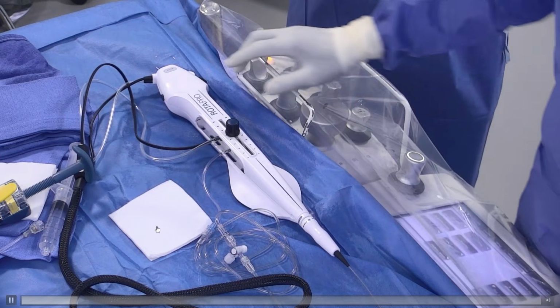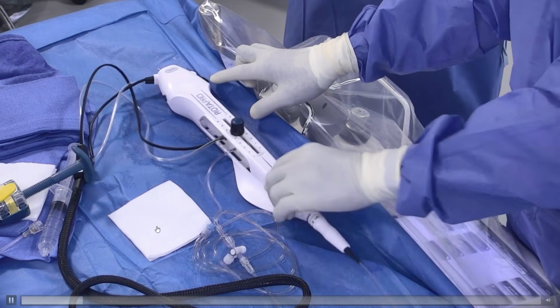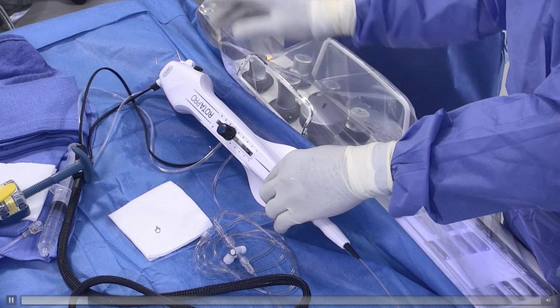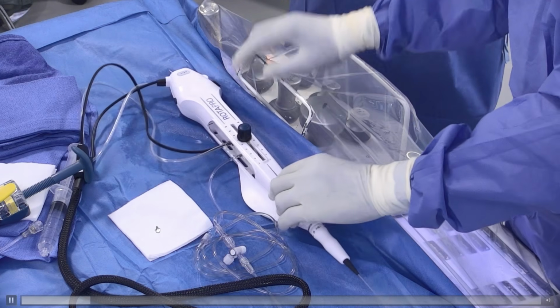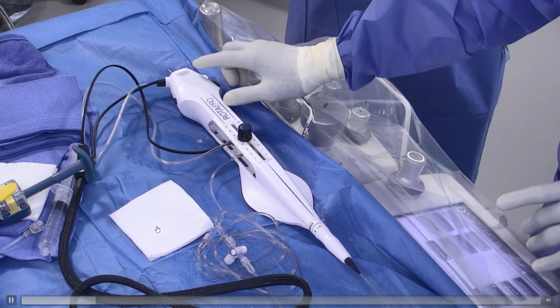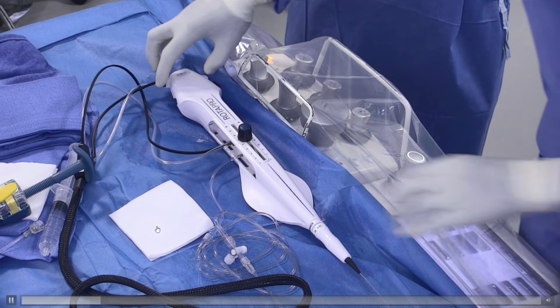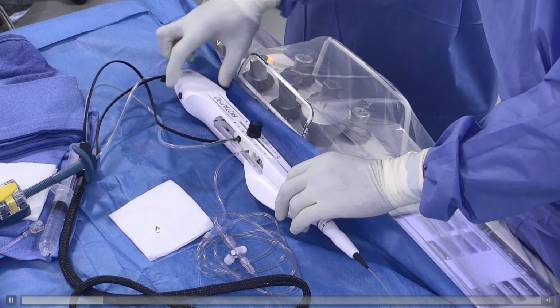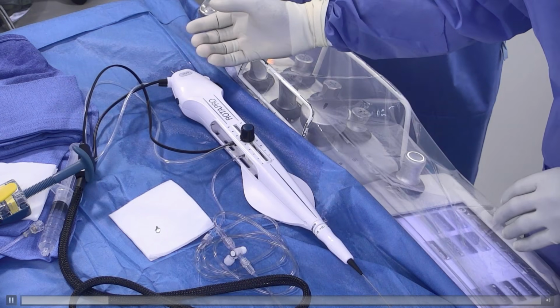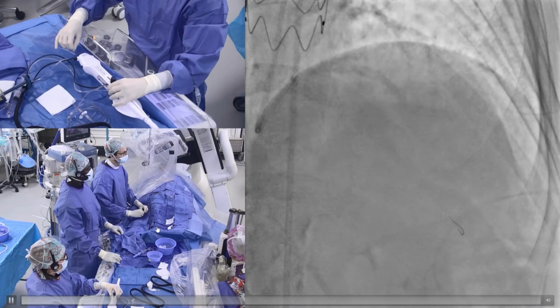More proximal, that black knob is just a brake release knob, so we may utilize it depending on the frictions that we have in the system. What is also new for this RotaPro system is that DynaGlide activation button. At the end, Melody is going to press both buttons at the same time just to activate the DynaGlide feature of that RotaPro system.